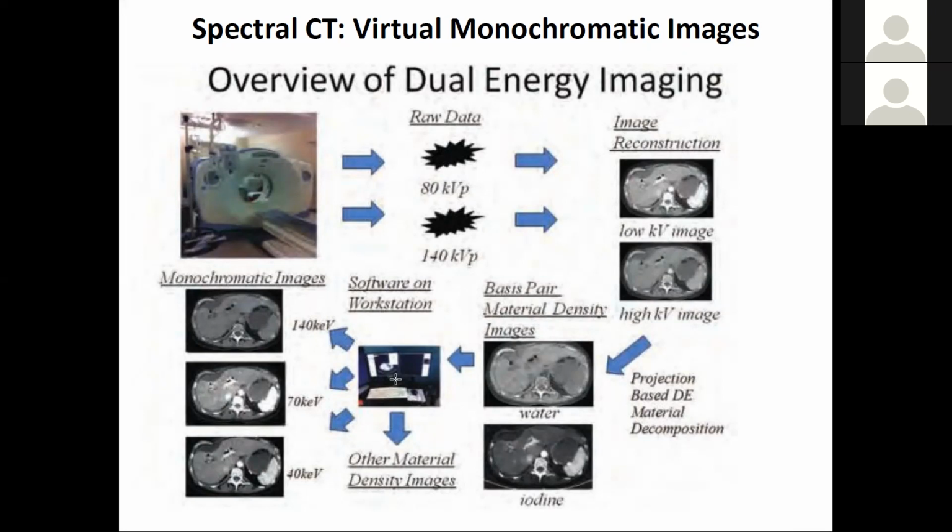And that's helpful for your reconstruction down the line, particularly for your quantitation. But it's also useful to have these other types of images for practical purposes, where you can say, okay, where's your iodine, where's your water? What would it look like if you had not done a contrast injection on somebody you just did do a contrast injection on? That type of stuff.